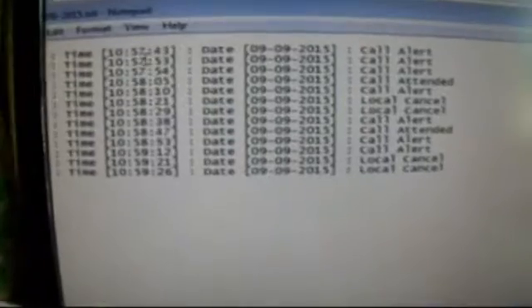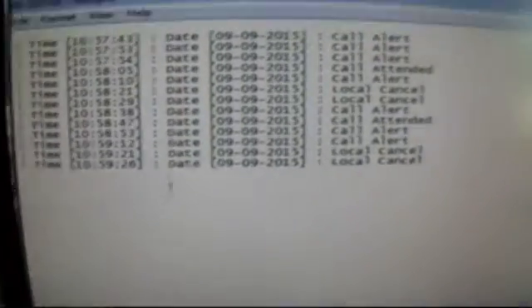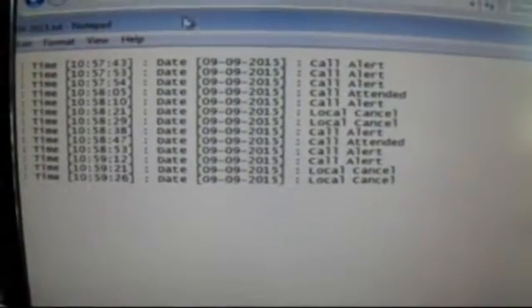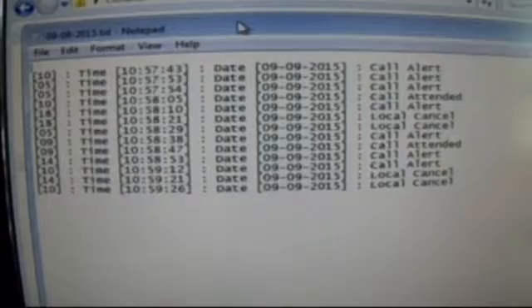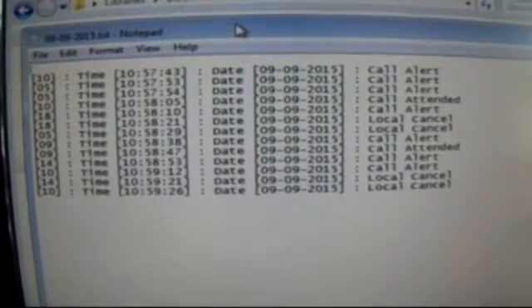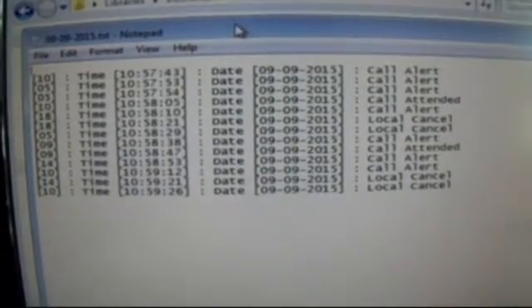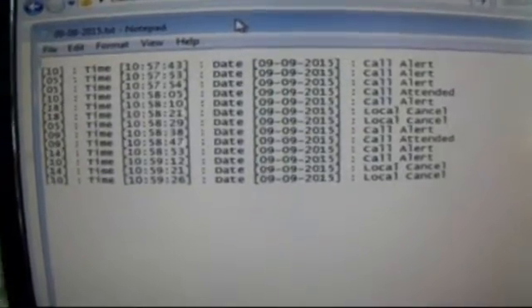Let us show you the log file that got created during this operation. This file has the information about the calls — when did a patient call, when was he attended, etc.